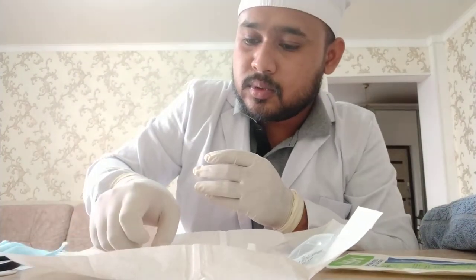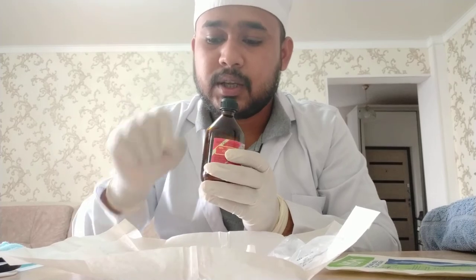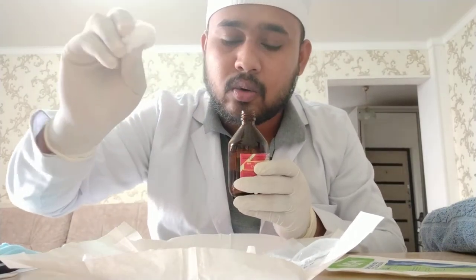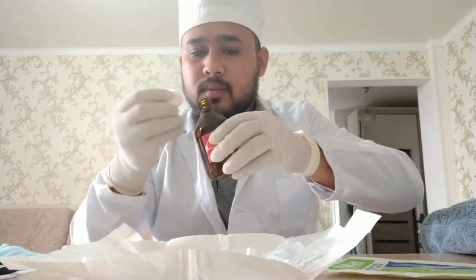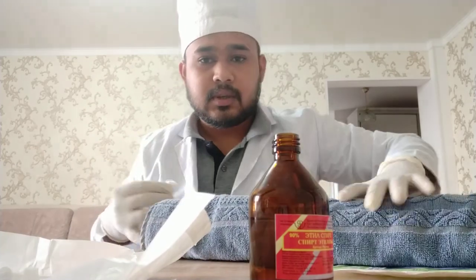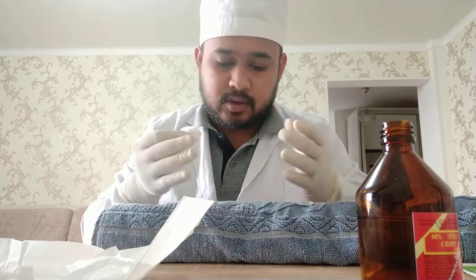So I prepared the injection or the syringe. Now I will disinfect the area or the place where I will put the injection. I made previously the cotton wool — dip the cotton wool into spirit or any disinfectant. I made this towel by wrapping it as a hand model, so I will disinfect the area. Suppose I will put the injection over here.